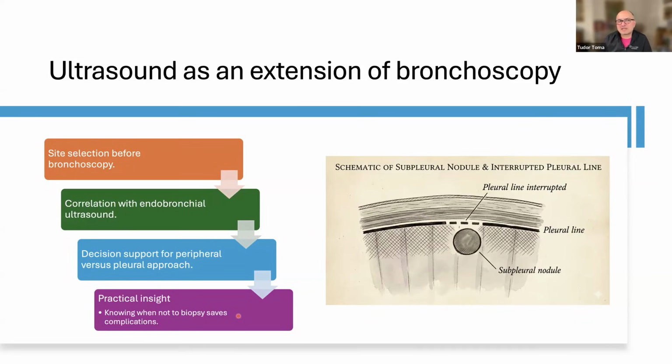And that's not to say that we need to do everything in these peripheral centers, but we can stratify and do what we can in the periphery and reserve the use of the expensive interventional bronchoscopy or pulmonology rooms for more complex patients and complex procedures.